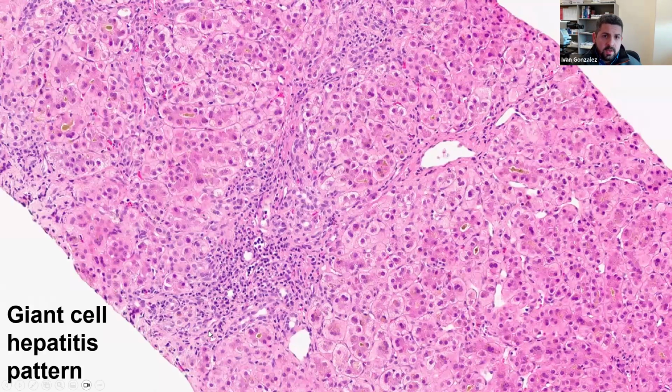If you look at the portal tracts, the action is not happening here in the portal tract, and that's very important. You may see some mild bile duct proliferation, but you won't see a prominent ductal reaction or bile plugs. You see that when you're talking about an obstructive pattern. And you have a very prominent extramedullary lobular hematopoiesis. Here in this photograph, I'm not showing that. And coincidentally, the myeloid EMH will happen in the portal tract, and the erythroids will happen in the lobule.